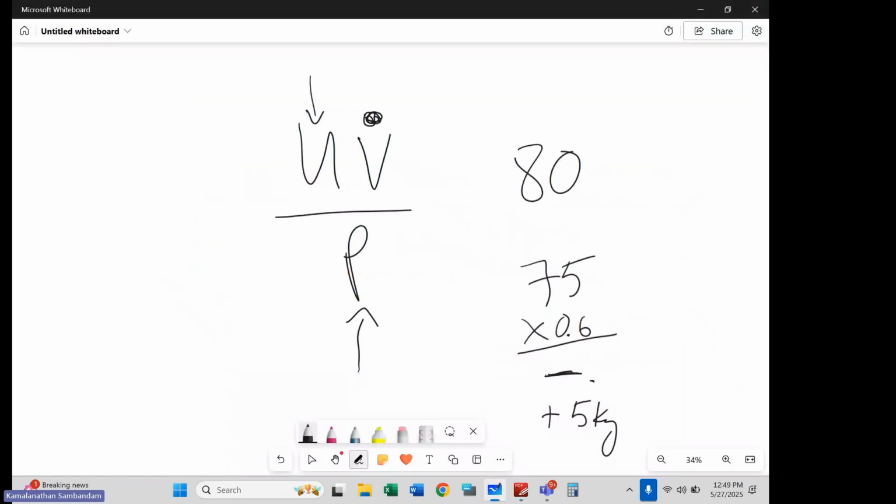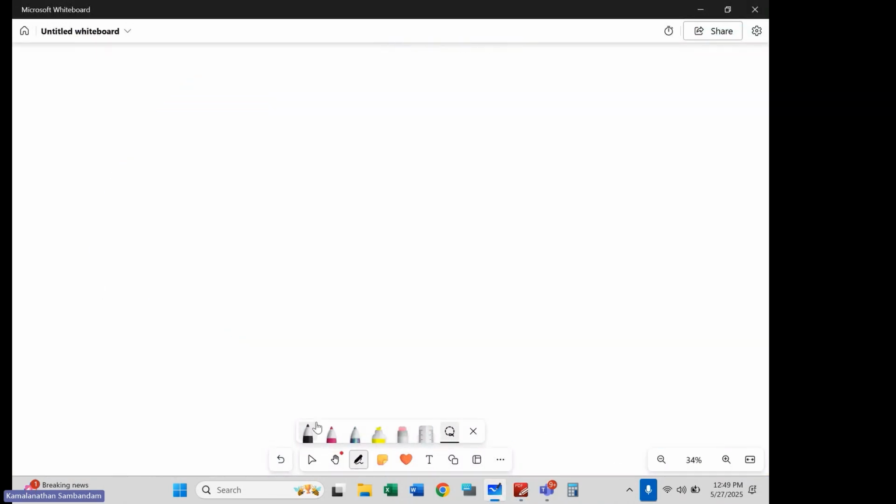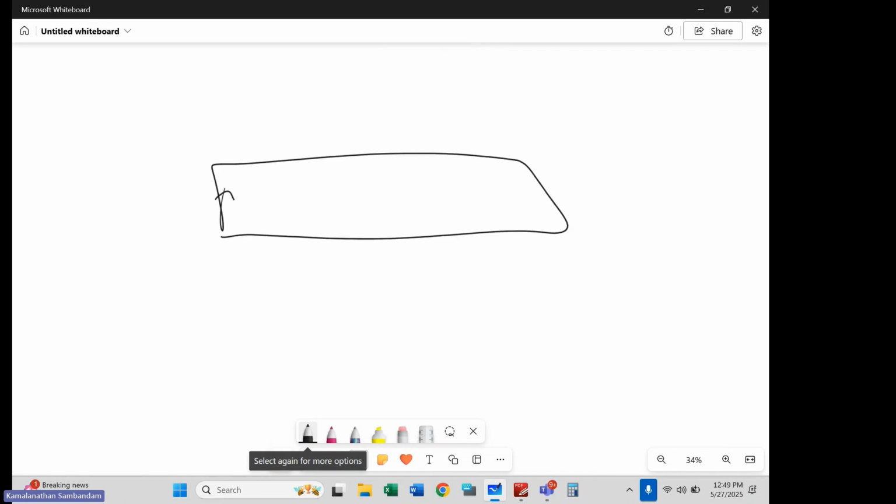So what's happening when you're using online clearance measurements? The assumption is that urea, a small molecule, will act like sodium, another small molecule, right? And so it's essentially measuring the flux of sodium and using that as a marker for urea flux.